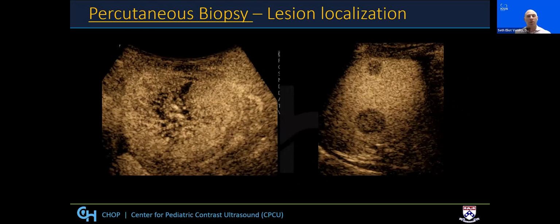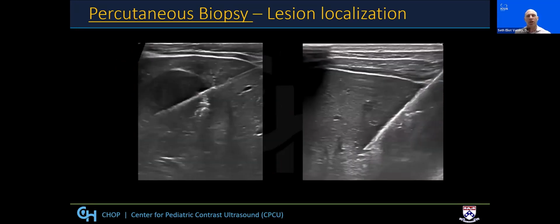Now, contrast-enhanced ultrasound really improved the visualization of this lesion, and we felt very confident being accurate with our sampling under general anesthesia. So 2 lesions were sampled, and the resulting pathology was EBV-associated smooth muscle tumor, which was an unexpected finding. This is a rare tumor of uncertain biological potential that occurs in immune-suppressed HIV and post-transplant recipients.